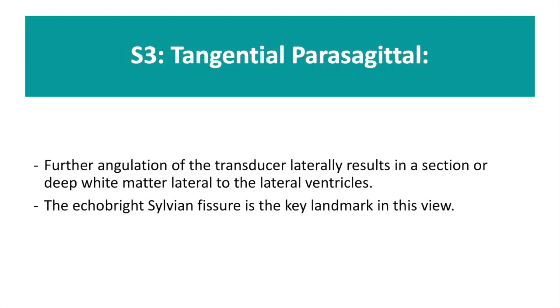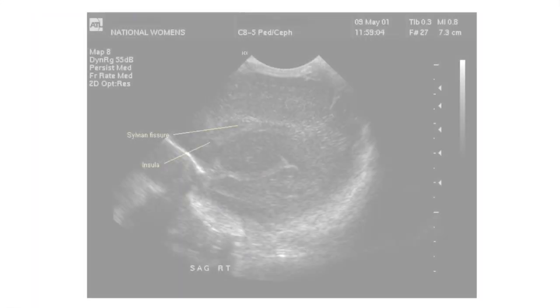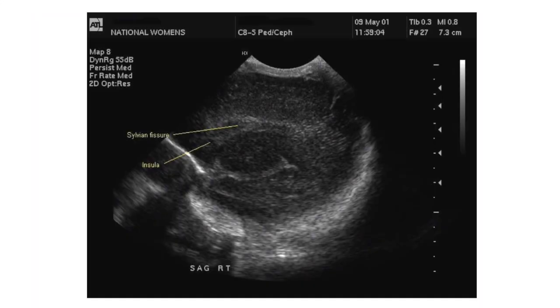S3, the tangential parasagittal view, is obtained by further angulation of the transducer. This shows the deep white matter surrounding the lateral ventricles. The echo-bright sylvian fissure is the landmark for this view.